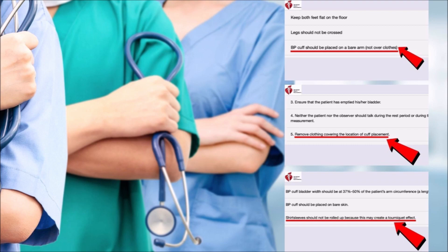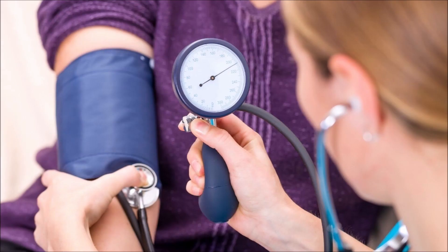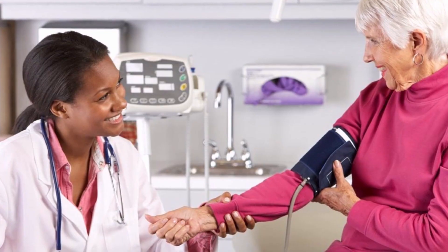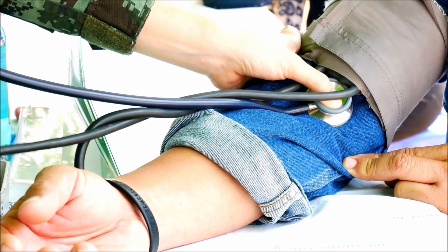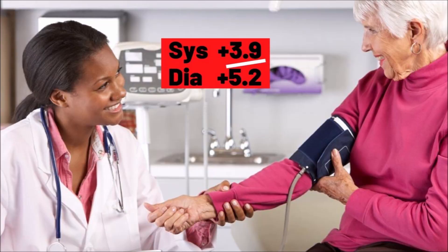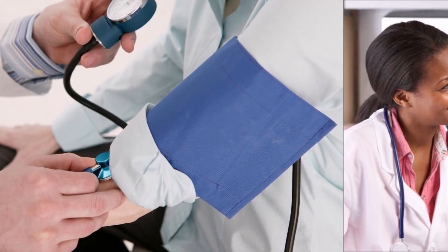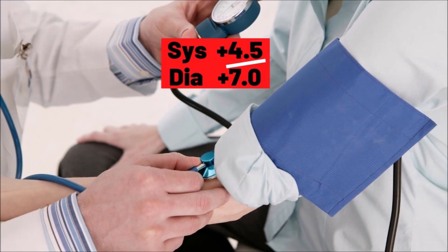Now that we know what the experts recommend, what do the studies show? In one study of 186 people, their blood pressure was measured three times: once with a bare arm, a second time over a long sleeve, and a third time with a rolled-up sleeve still covering the arm. With the cuff over a sleeve, the systolic measurement increased 3.9 and diastolic increased 5.2 compared to a bare arm. With the doubled-up sleeve, both systolic and diastolic increased even more than just the single layer sleeve.